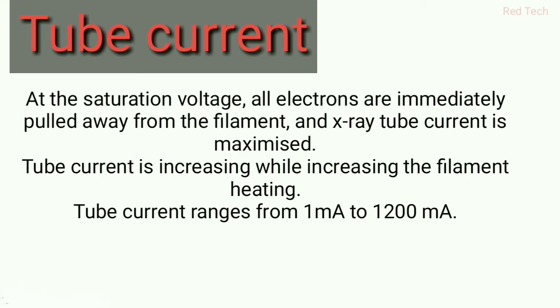We have to remember the point that if we power up the filament, or you can say heat up the filament, the emission of electrons follows in the same way, or you can say tube current is directly proportional to the heating of the filament. That's basically what we have to understand about that. So I hope you are clear on all the points.